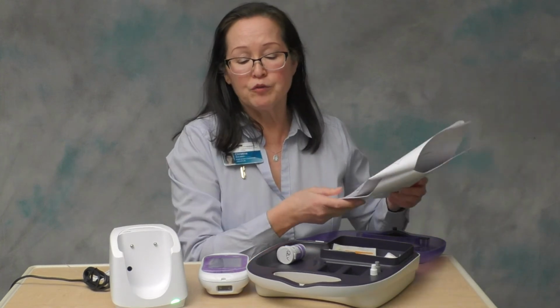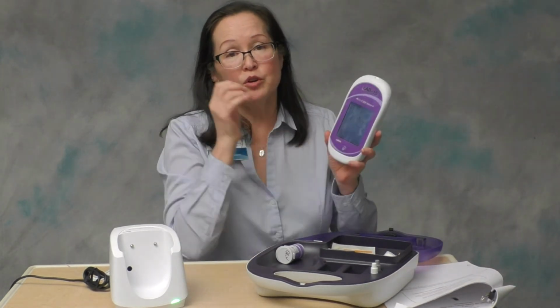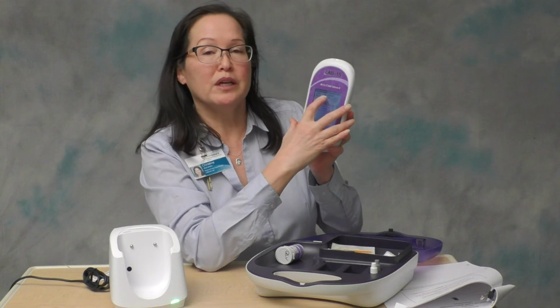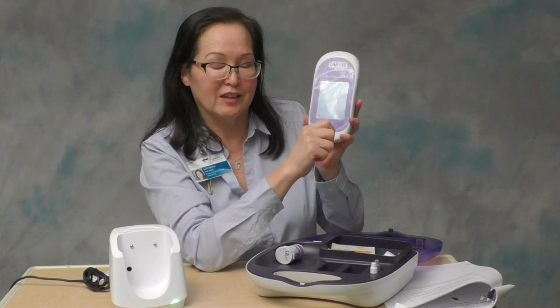All right. If when you're running QC on the floor, you get a QC failure, first thing, check to make sure that you dosed it with the correct bottle. When you've scanned the bottle, right at the top of the screen, it will tell you control L1 or L2. So that will indicate to you which bottle you scanned, just in case you forgot which bottle you scanned.